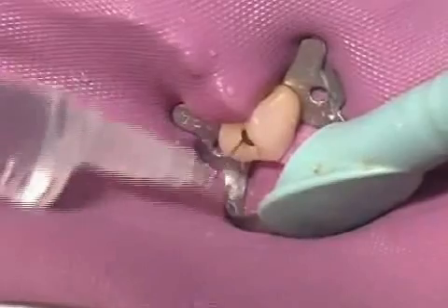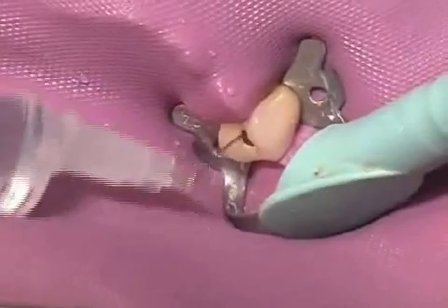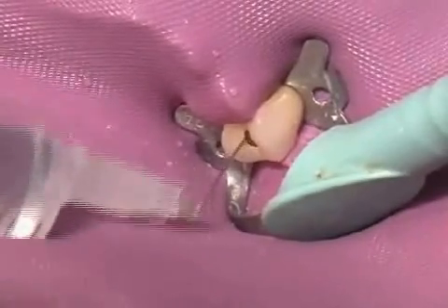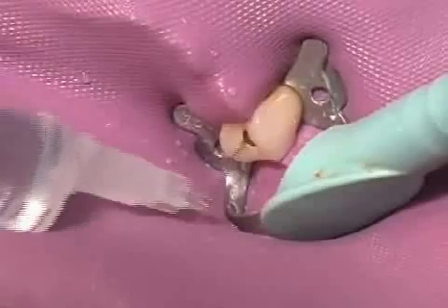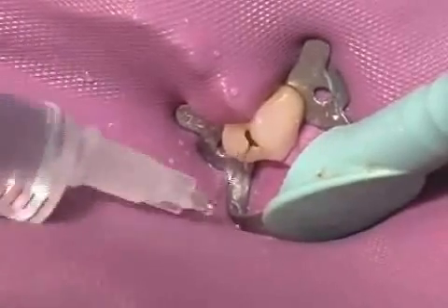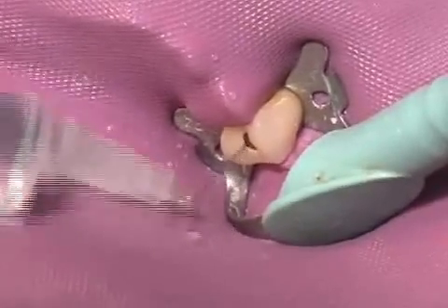As was already mentioned, this procedure should take 2 or 3 minutes for each canal, as this is the only way to get the canals truly clean. After rinsing, the canals are dried and filled.